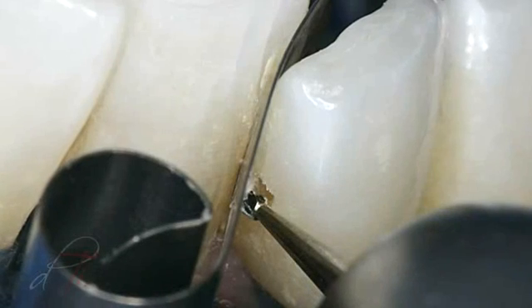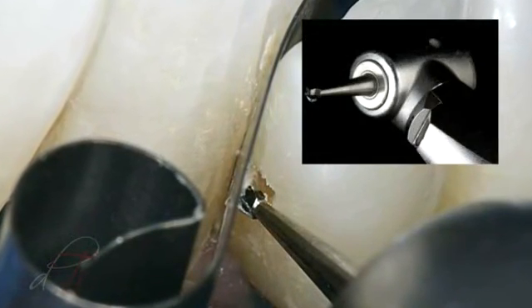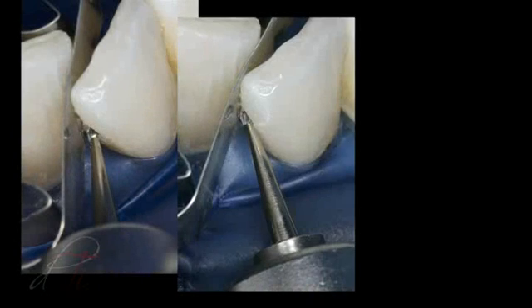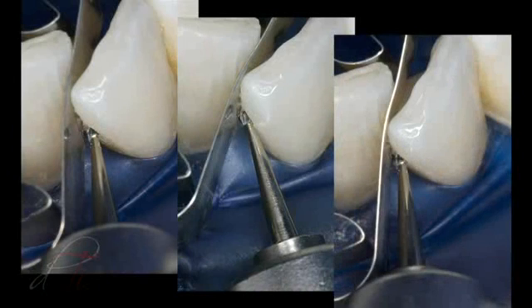Once anesthesia had been administered to the patient, the caries was removed with a number two high-speed round burr, which produces rounded line angles. The outline form was as conservative as possible without removing healthy tooth structure unless dictated by caries.